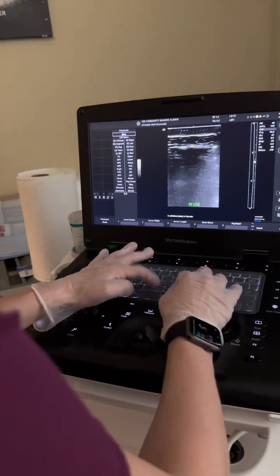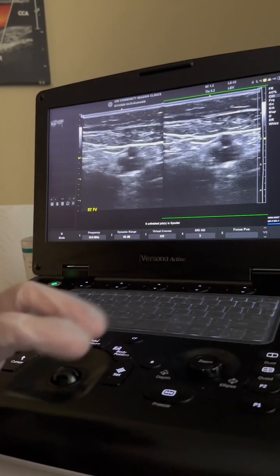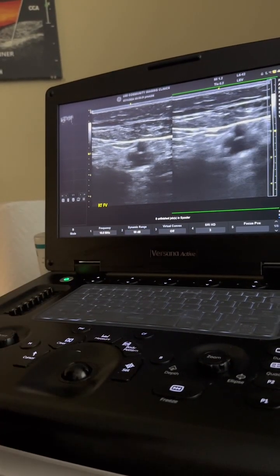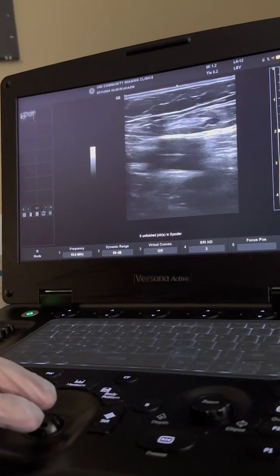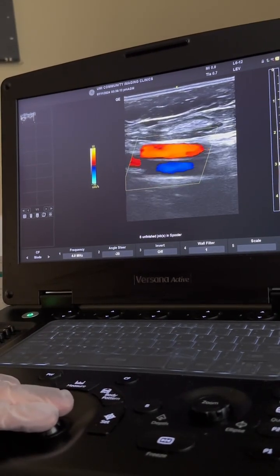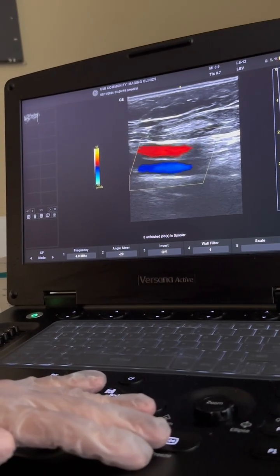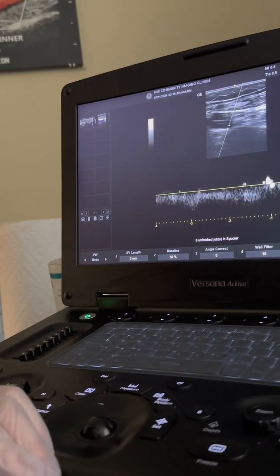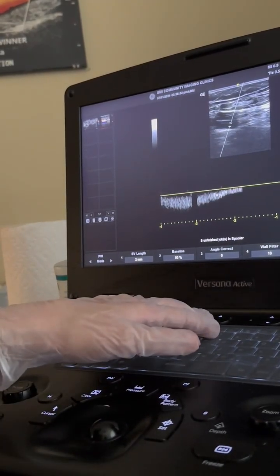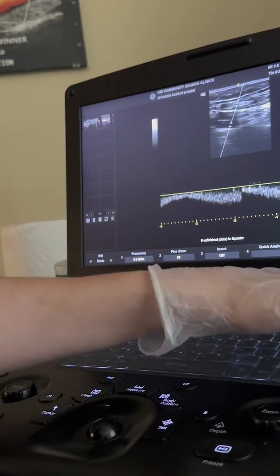As for the deep system, I'm going to start off with the common femoral vein. In transverse position, I'm going to get a dual image of non-compression and compression of the CFV. I then want to turn the CFV into sagittal position and apply color so we know the direction the blood is moving, as well as the angle box. We're then going to apply PW, which stands for pulse wave. This helps us reflect sound waves between the pulses in each vessel. Also, make sure to adjust your baseline and your horizontal sweep.